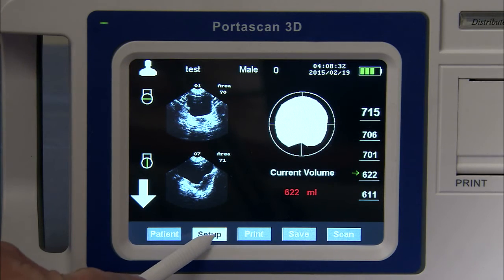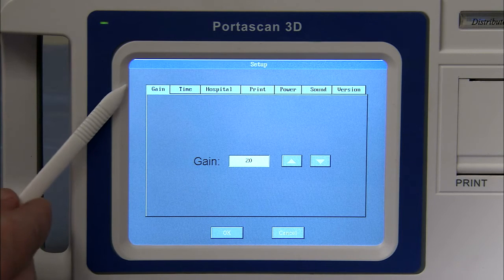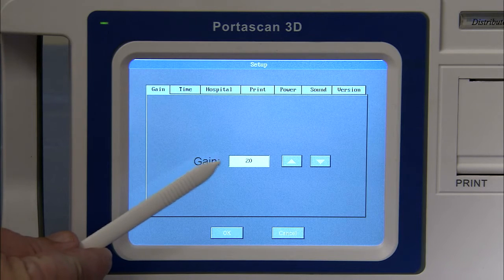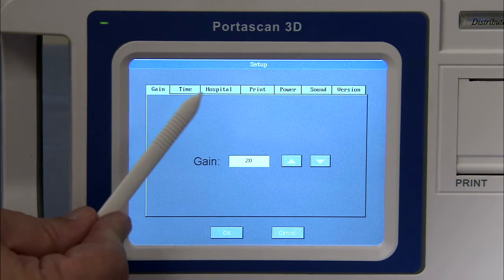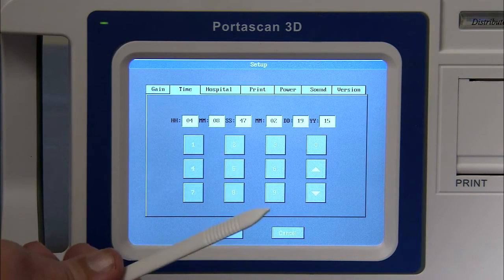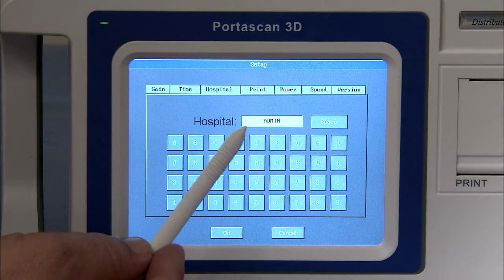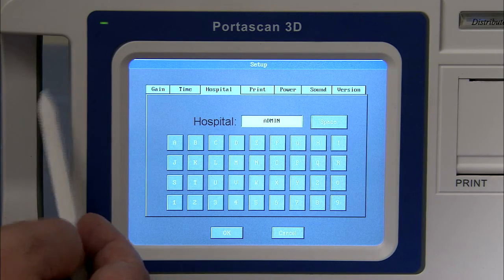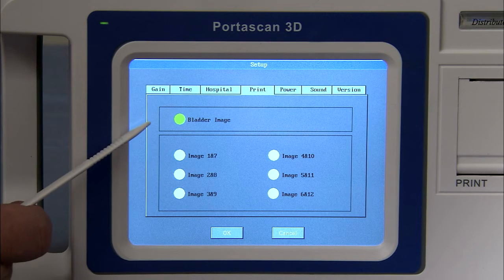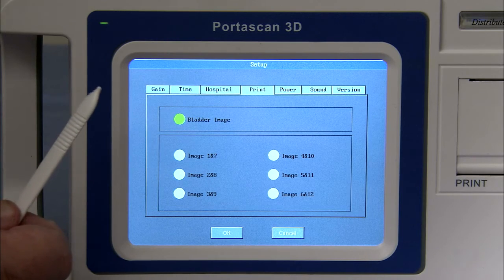Now we can go to the setup button. By clicking on setup, it will take you to another menu. At the top of the screen, the first option is the gain option, which is always set to a default of 20 — do not change this setting. The second button is time, which allows you to change the time for your current location. The third button is your hospital or practice name, which you can change. The next button is print — normally set to print just a bladder image, though you can print multiple images; we suggest keeping it as the default.